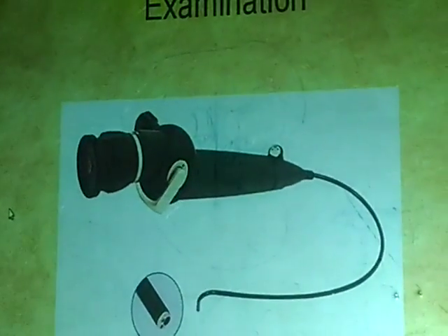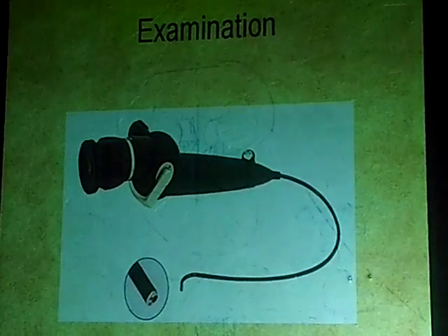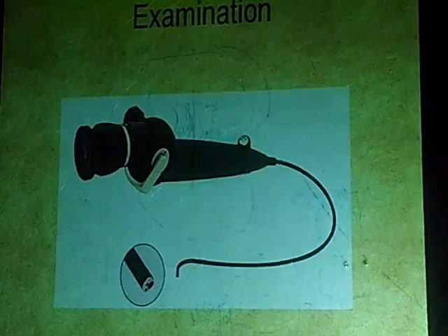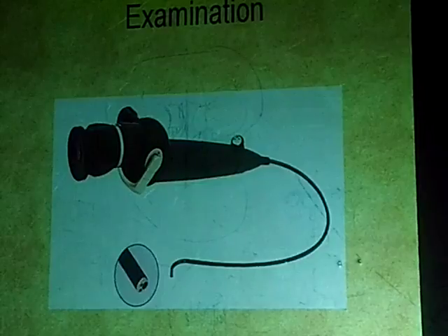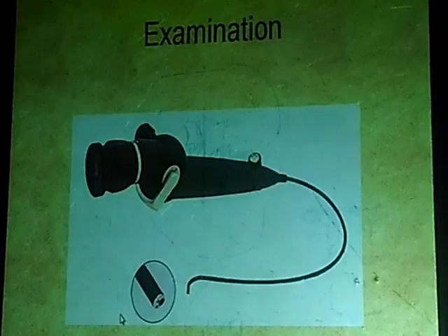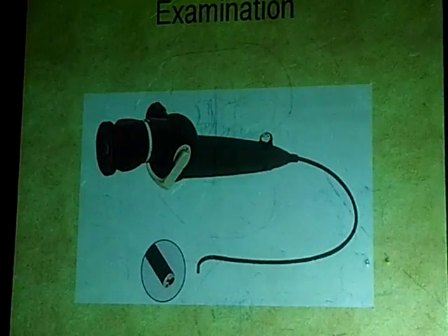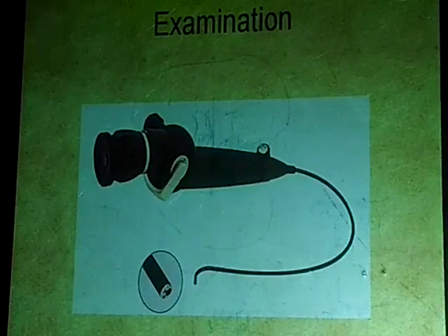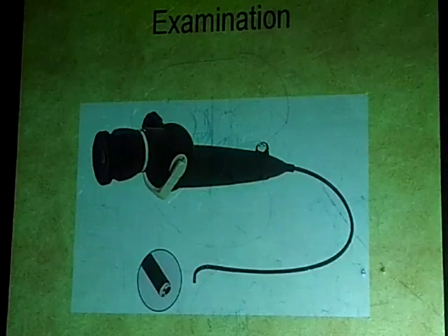Now, how can we examine a child with an enlarged adenoid, or somebody in whom we suspect that the cause of his nasal obstruction is the adenoids? We have two tools for doing this, either the nasopharyngoscope or the plain lateral X-ray. To me, I think now in our time, we should always consider doing examination by the flexible endoscope, and even by the rigid endoscope if the child is above the age of 5 years and he can tolerate it, because the nasopharynx is a 3-dimensional space, and to look at it by a 2-dimensional image like the X-ray, you will never get an accurate image.